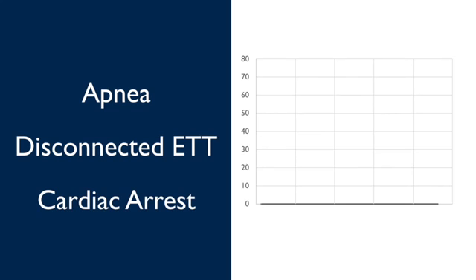It should come as no surprise that a sudden drop in your end-tidal CO2 to 0 could represent a cardiac arrest because this is the ultimate in terms of dead space. There is no pulmonary perfusion that is occurring during a cardiac arrest, and therefore no carbon dioxide making it to our detector. With all that said, let's talk about how to use capnometry to manage our coding patient.